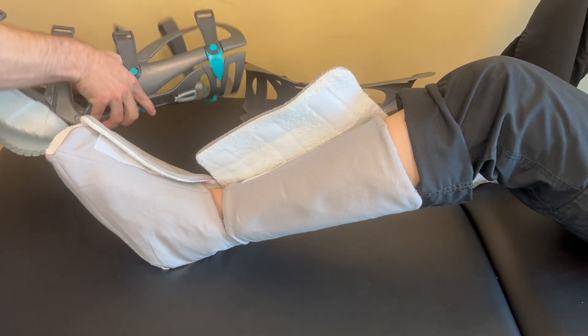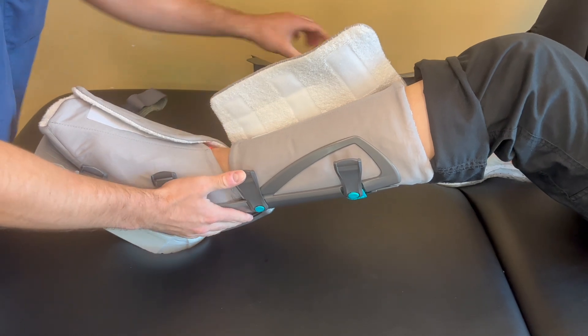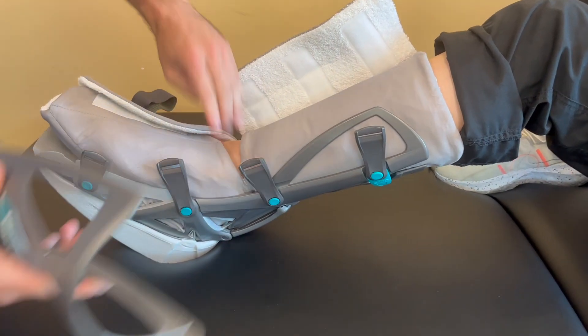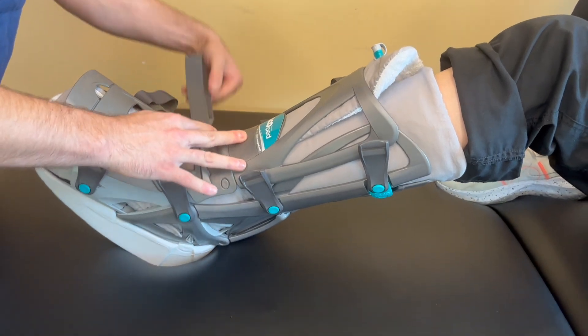Next, place the lower leg into the shell of the boot. Please ensure that your foot is flat against the bottom of the boot. Your heel should be placed into the shell as far back as possible. Depending on your range of motion restrictions, your foot may be placed into a plantar flexed or downward position, like you are stepping on the gas pedal.